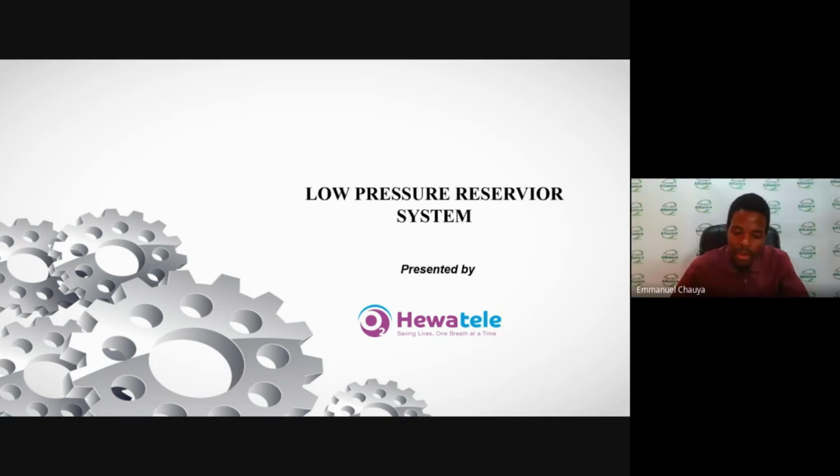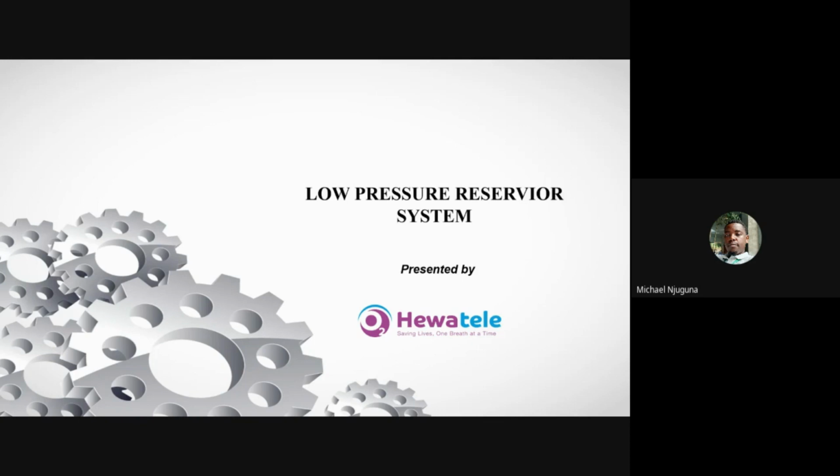Okay, so thank you, George. Kevin, you let us know if that answers your question. We have a couple of questions in the chat. I'll read them out to you. We have another question from Chimwemwe TS, and he asks, do you have a pressure regulator between the tank and the flow meter? There is no pressure regulator per se, but the feature between the tank and the filling station is the pressure switch, which cuts off pressure at 5 bars.